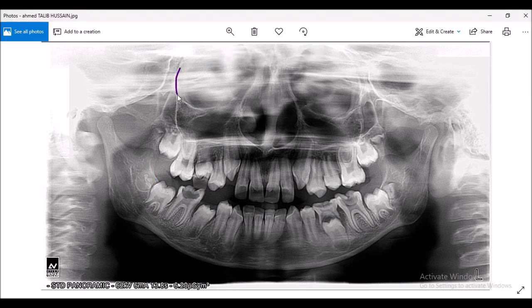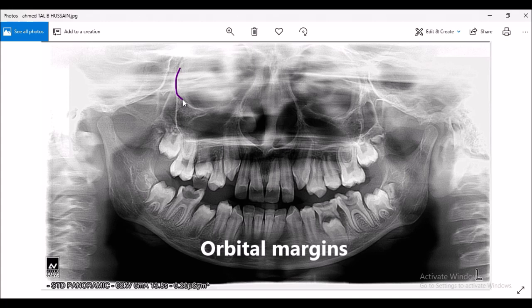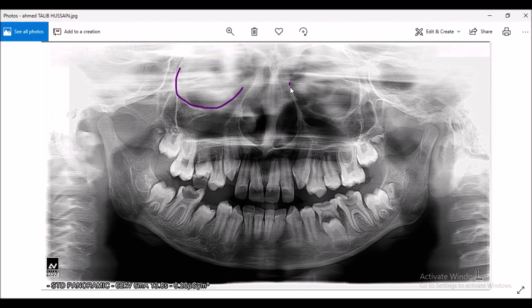These are the orbital margins. This is the orbital margin of the right side, and this is the orbital margin of the left side.